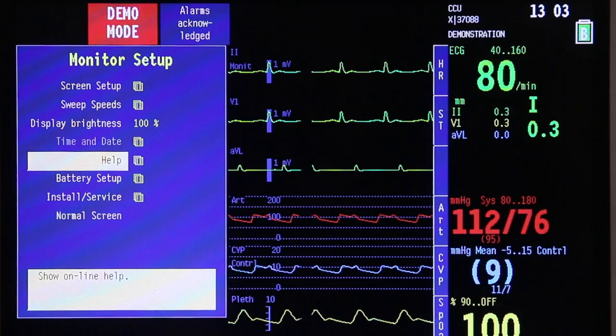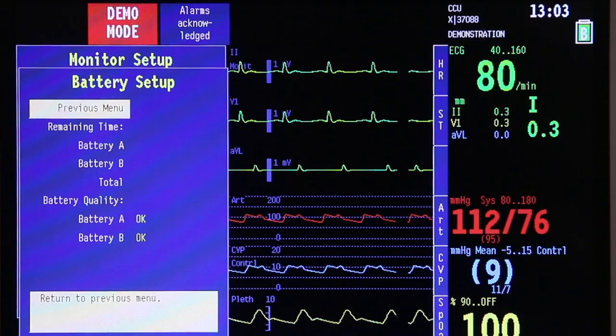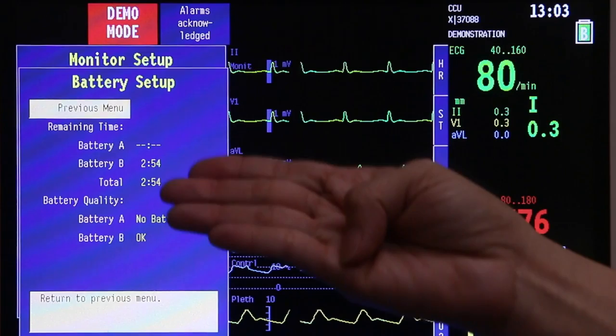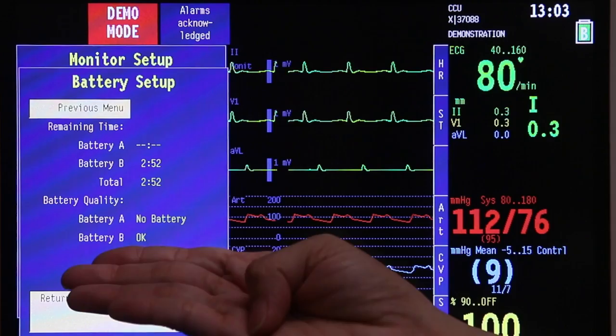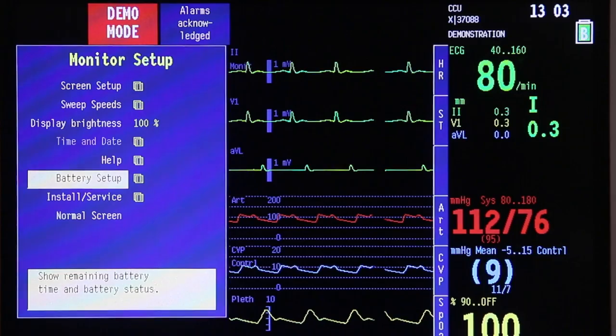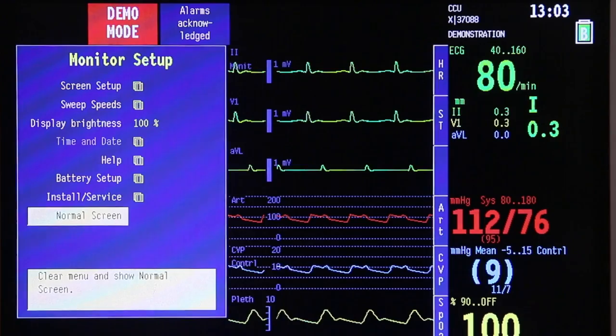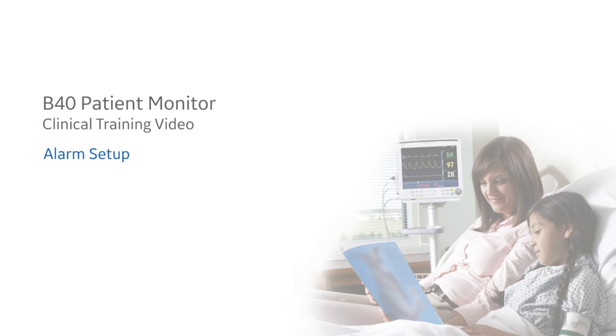If you want to check the battery setup, click battery setup and press the trim knob once. It will tell you the options — battery A and battery B. If you look at the screen, currently there is no battery for battery A, meaning you are only using one battery for this monitor at the present time. Once done, click previous menu, then back to normal screen, press once, and you are back to your home screen.